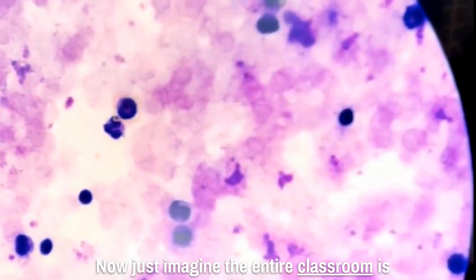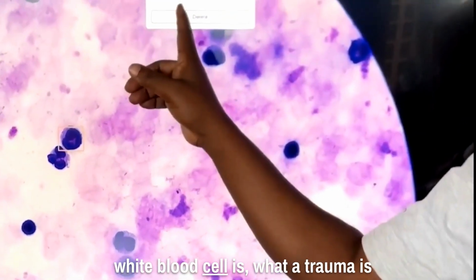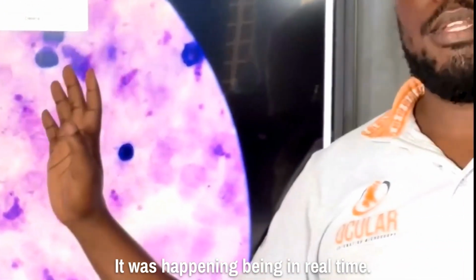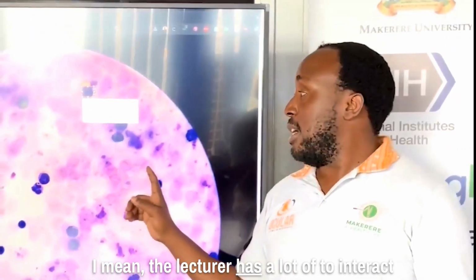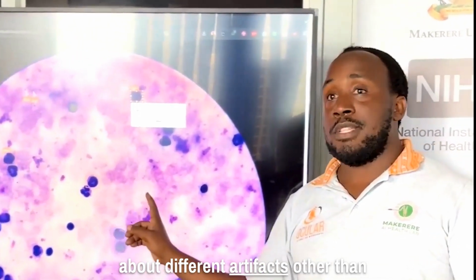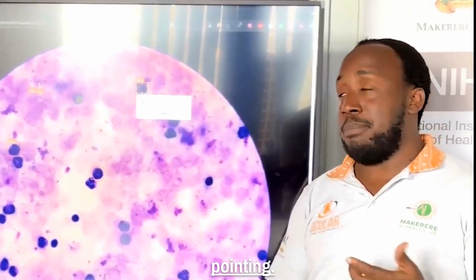Now just imagine the entire classroom is looking at this. That means they already know what a white blood cell is, what a trophozoite is, because this was happening in real time. The lecturer has an option to interact with all the artifacts, and they can teach about the various artifacts rather than pointing at them, expecting the students to understand by pointing.